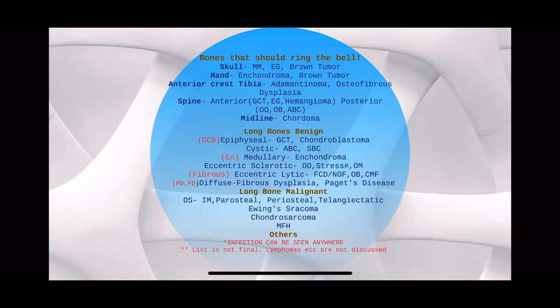Spine — anterior spine: GCT, eosinophilic granuloma, or hemangioma. Posterior elements: osteoblastoma, osteoid osteoma, or ABC. Midline: chordoma tumor — in the sphenooccipital or sacrococcygeal region. Long bones: differentiate if it's benign — no soft tissue extension.